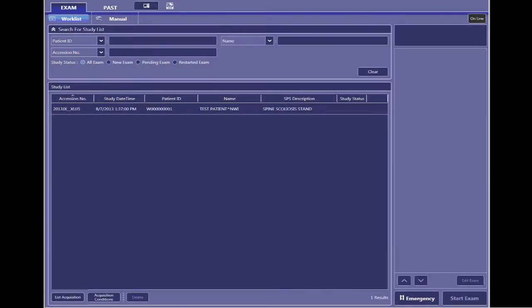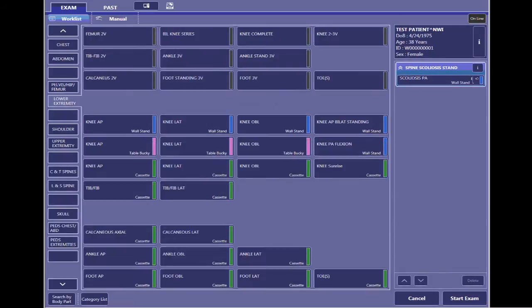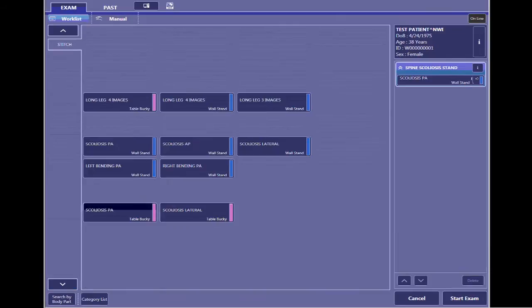First, we're going to set up on the Canon side of things. I'm going to highlight the patient name — it should automatically pick the program for you. If you want to change that at all, you would go to Edit Exam and click the down arrow to find your stitch page here. Whatever you would like to change it to, you can add. If you're going to do a lateral, you can add that in. Then you're going to click Start Exam.